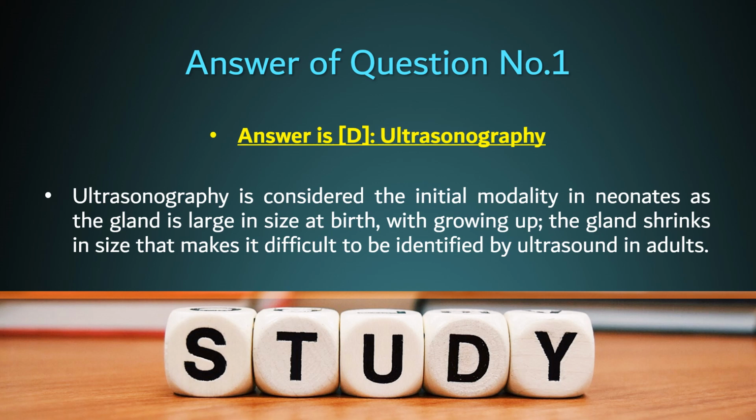Ultrasonography is considered the initial modality in neonates, as the gland is larger in size at birth. With growing up, the gland shrinks in size. That makes it difficult to be identified by ultrasound in adults.